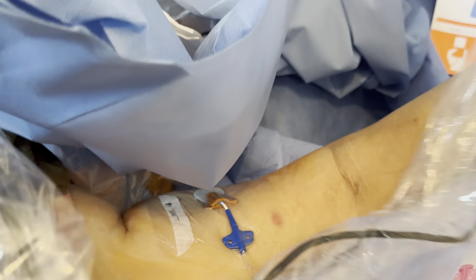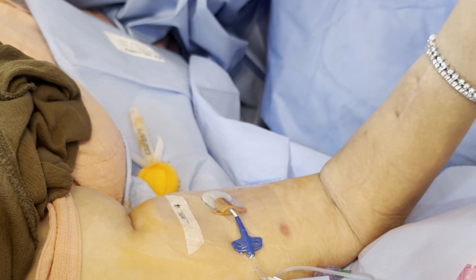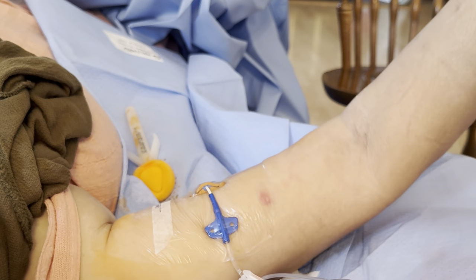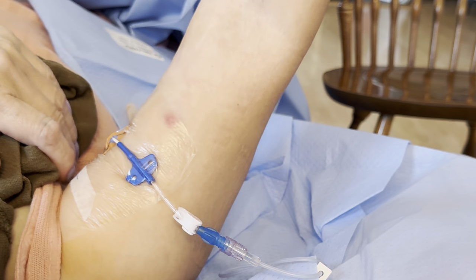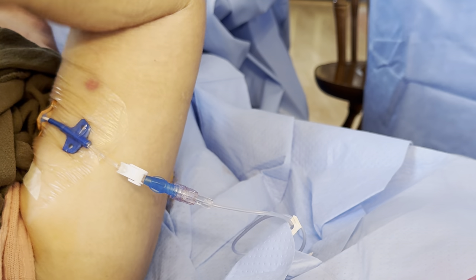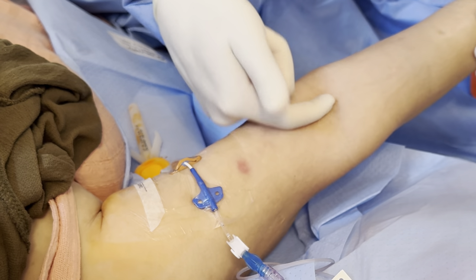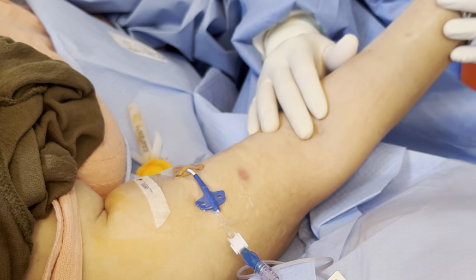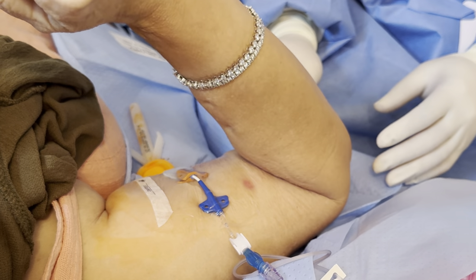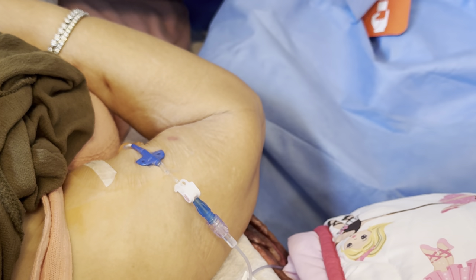You did very good — that's why I fell asleep. Was it better or worse than the last time? Better. Very gentle, very good. Can you move your arm? It's kind of stiff because I've been like this for more than 10 days. Now it feels better. The patient was saying this feels a lot more comfortable — the previous dressing was right here, so she had to keep her arm extended every night while sleeping. But now that she can bend her arm while sleeping, she's going to be a lot more comfortable. A good night's rest and being comfortable while sleeping is key to healing.